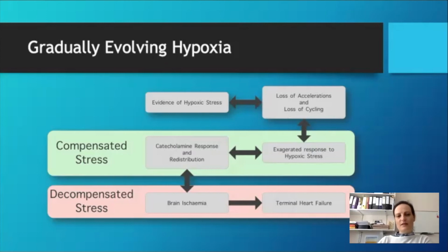I thought to say this because sometimes people panic. There's 5 minutes of subacute hypoxia and everybody thinks the baby is about to die. How long they cope depends on the baby, on the environment, on many things. So it's about individualized care.